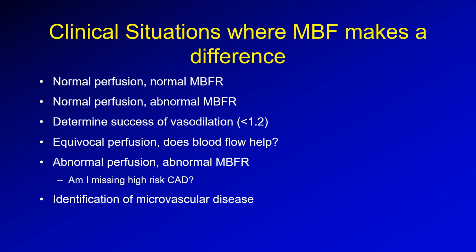And then lastly, the myocardial blood flow reserve makes a huge difference clinically for management of patients, because that identification of microvascular disease is extremely important.